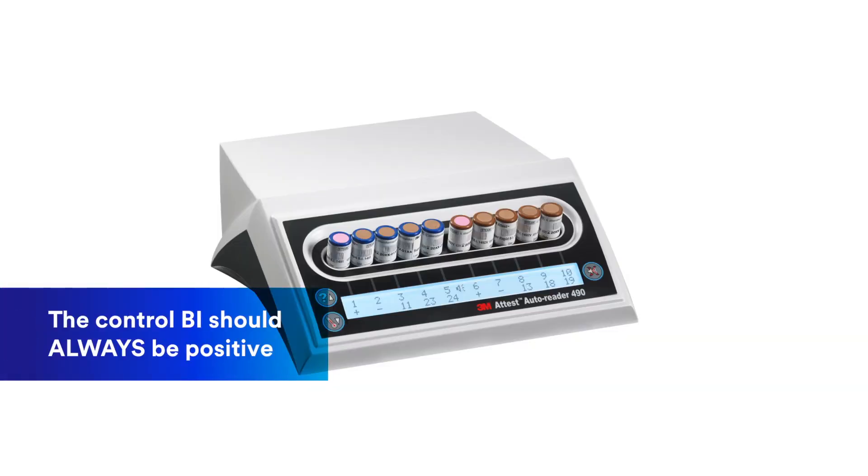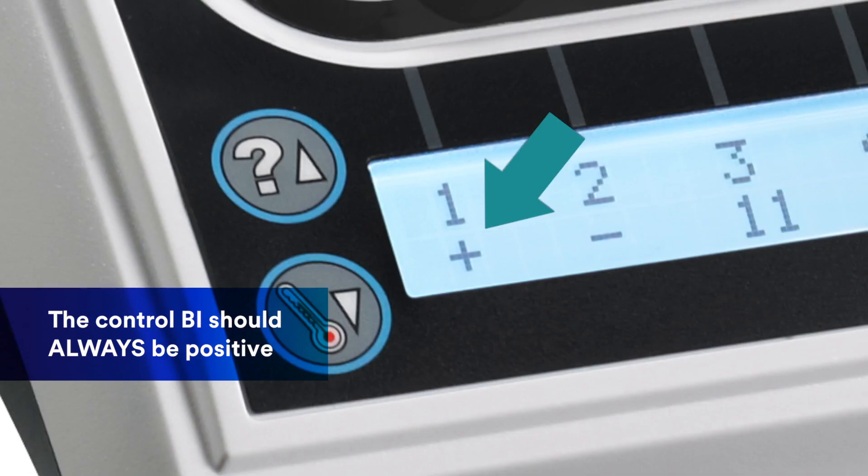A control BI with the same manufacturing lot number as the BI in a PCD should be incubated every day that a PCD is run. Because the control BI is not processed, it should always be positive.